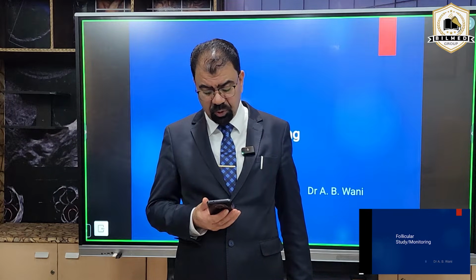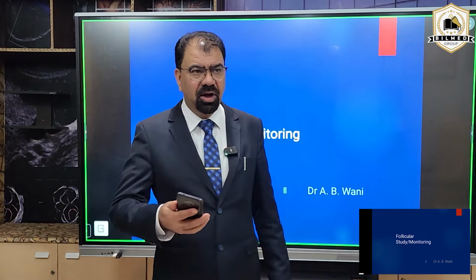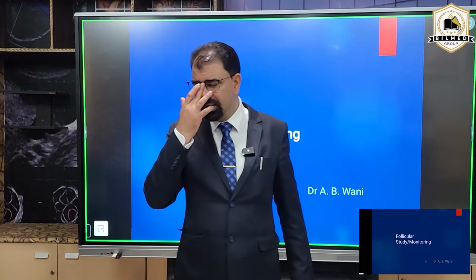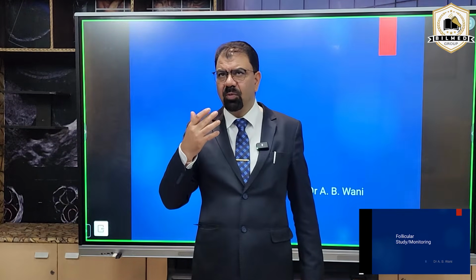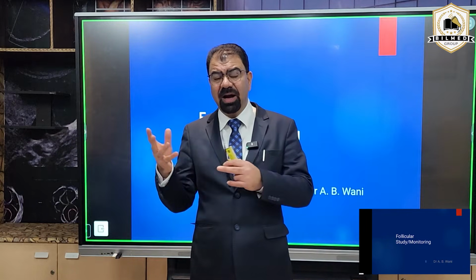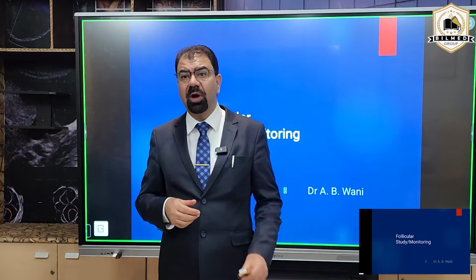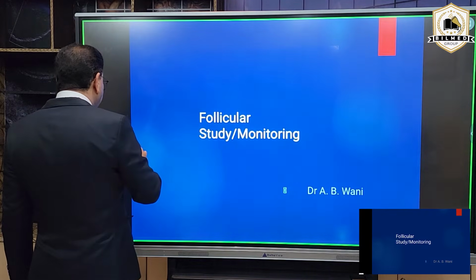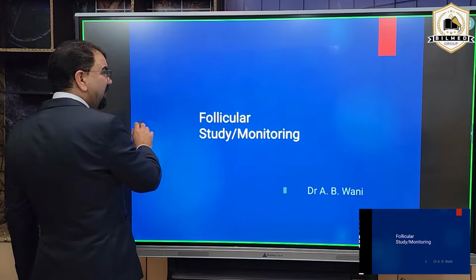POD fluid volume to indicate ovulation has occurred, sir. Now, let me elaborate the question: what is the role of the POD fluid if I have a ruptured follicle? I told you that we should have a baseline scan.